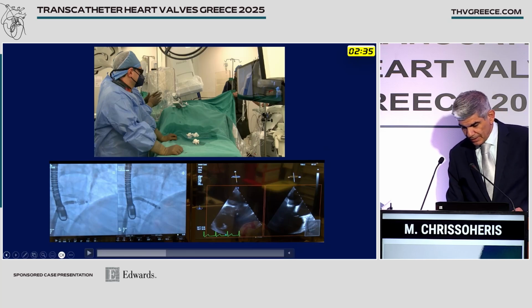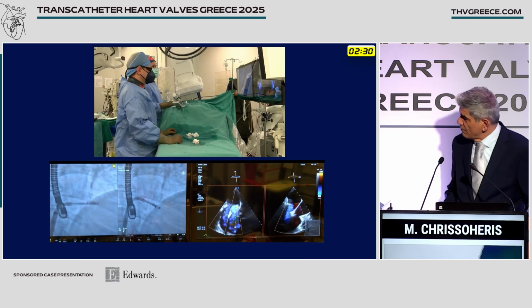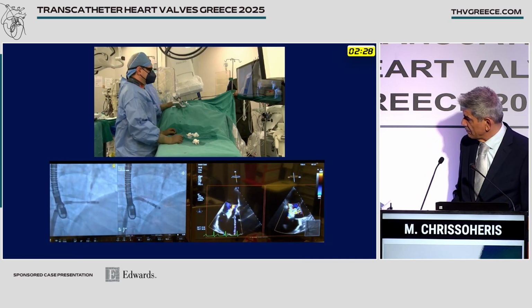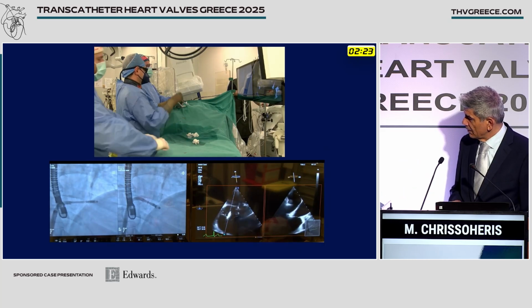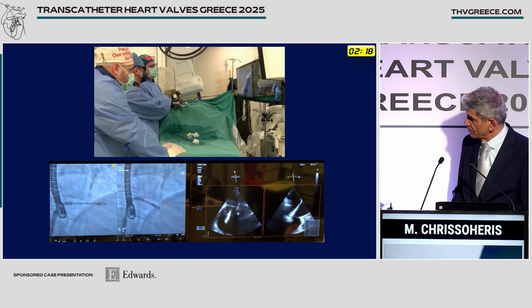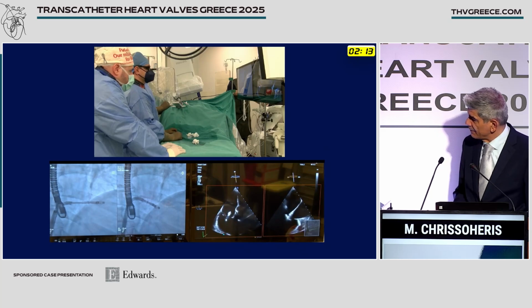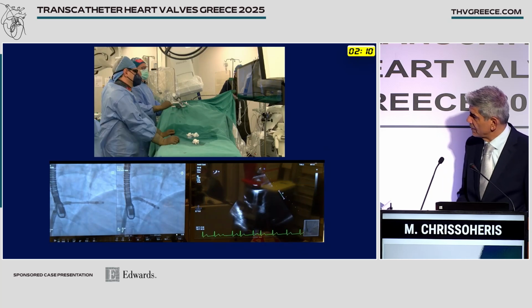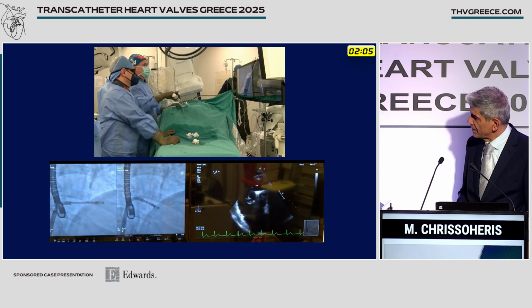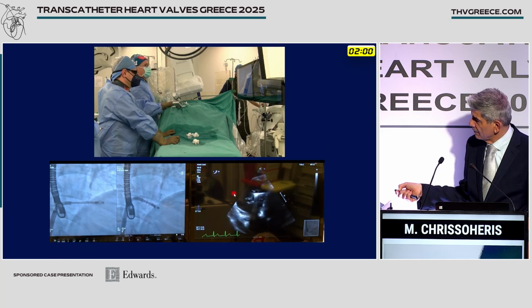So this is what we are doing at this point now. We changed completely our strategy, moving on to the center of the valve, with our goal to grasp septal posterior first. As we couldn't really move this first device to a different position, we said, let's go for the posterior septal first, and then we'll see what happens. So here we have, again, the same sequence of events. We assess our clocking on a transgastric view to be a 3-9 configuration for this septal posterior part here.